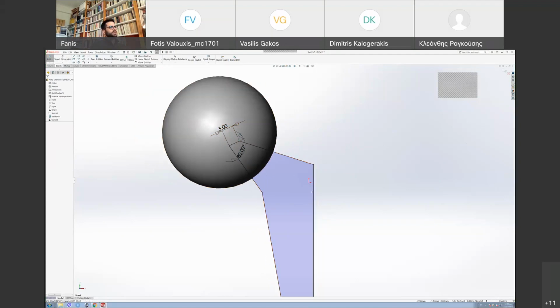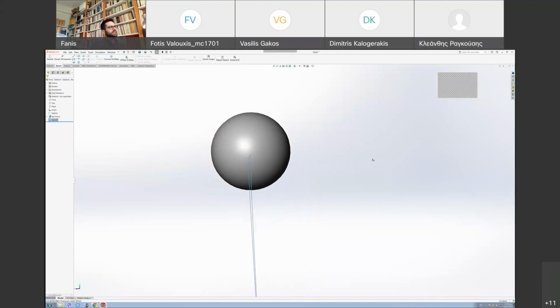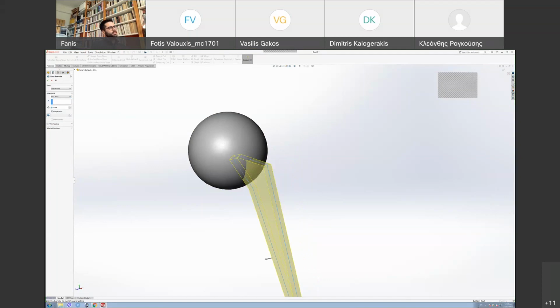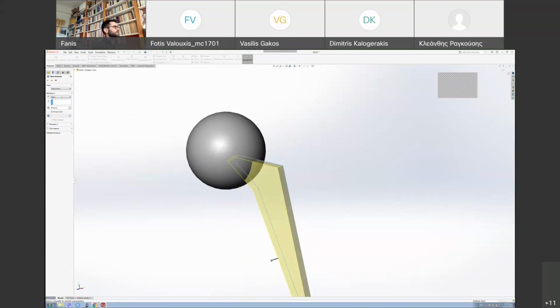So now we have a closed shape and we can extrude it. Make sure, because that is essentially in the middle of the sphere, when you try to extrude it, make sure you choose here from the mid plane. So if I have a thickness, for example, of 6 millimeters, okay, then it extrudes 3 millimeters from the one side of the plane and 3 millimeters from the other. If you choose blind, it goes all the way up and then it's off center on the sphere. I'm not sure if you can see it correctly, but that's the idea.